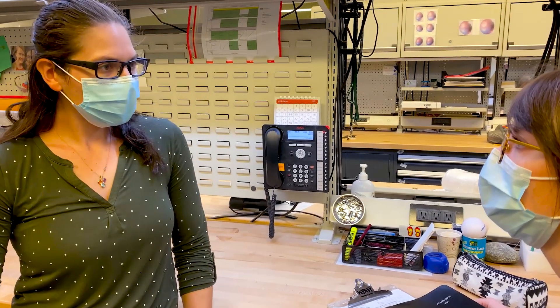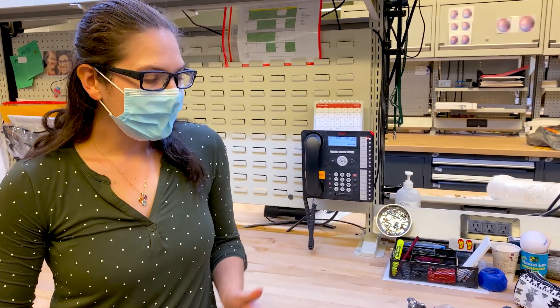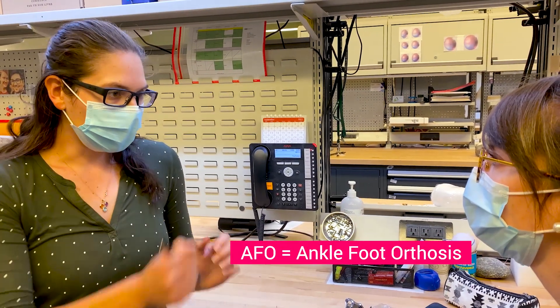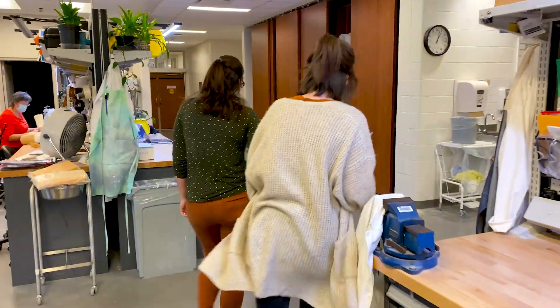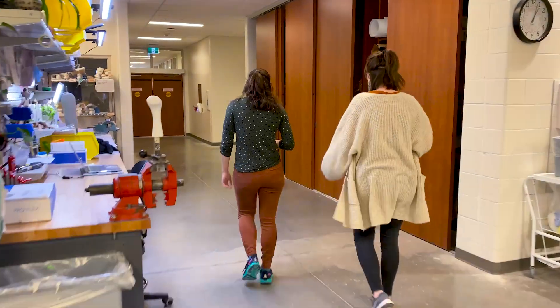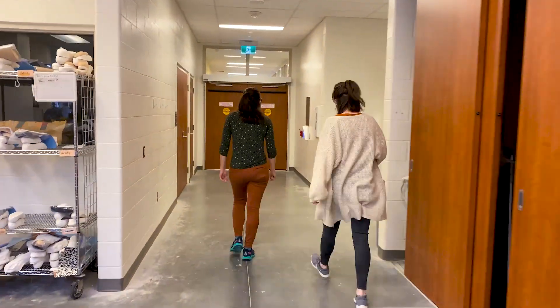So I have a 70-year-old woman who's having a lot of mid-foot pain on the left. I really want to get her an AFO with a medial T-strap to pull her back up into neutral alignment. An ankle-foot orthosis is a brace that helps control ankle movement and provides stability — something this patient desperately needs to help manage her severe foot pain.